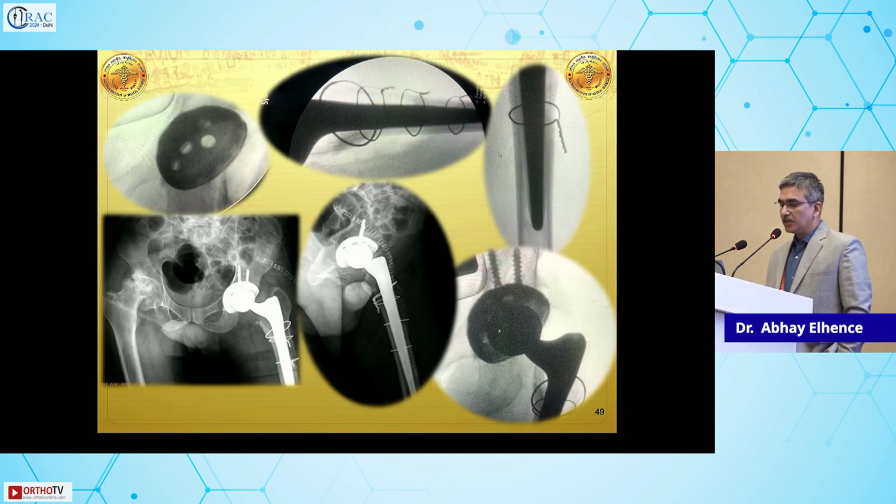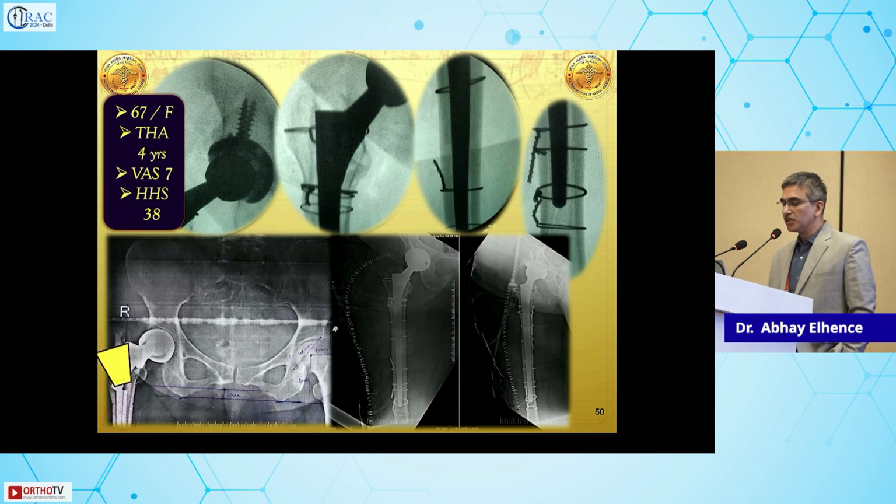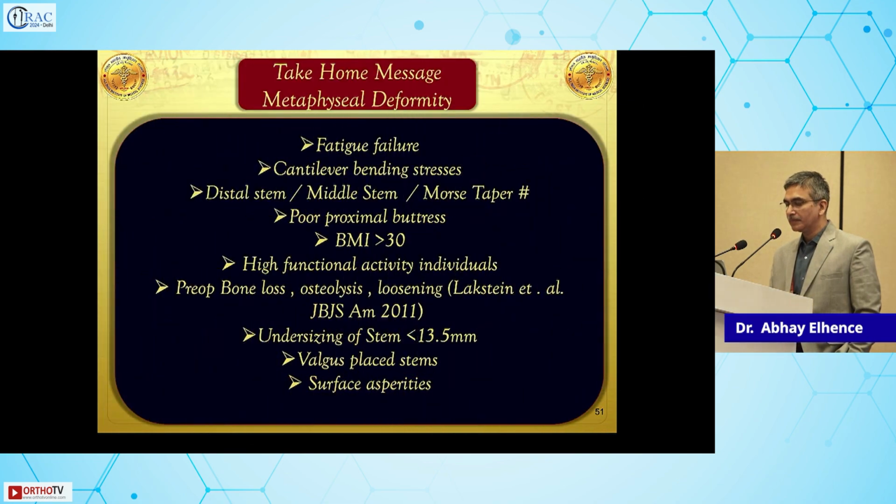So this is the patient, did well, had an acetabular reconstruction and got a distal fixing stem. Another patient, similar situation, similar result. We had a perforation while introducing the stem, but which we could manage with just wire fixations, and this patient had a delayed weight bearing, but eventually did very well.